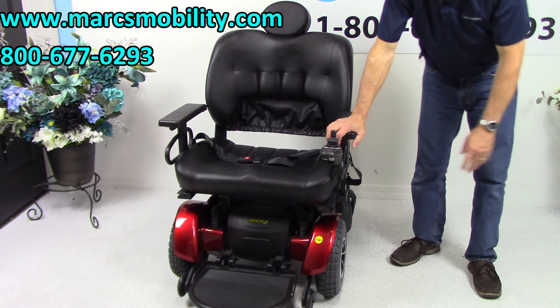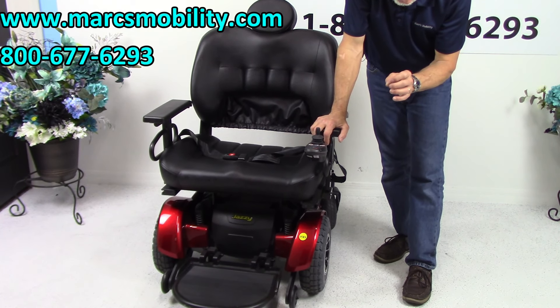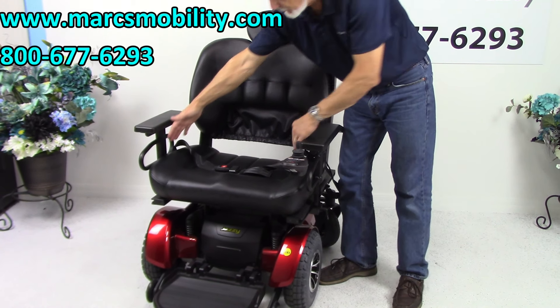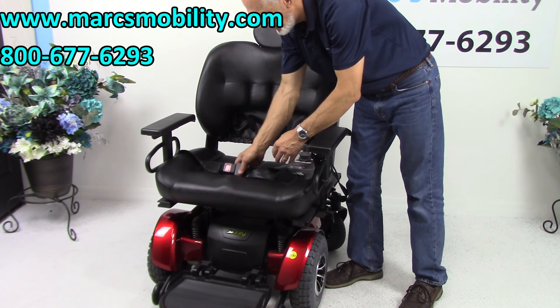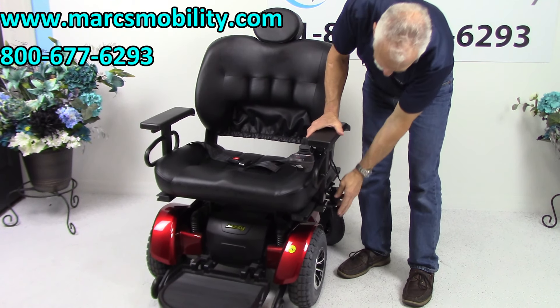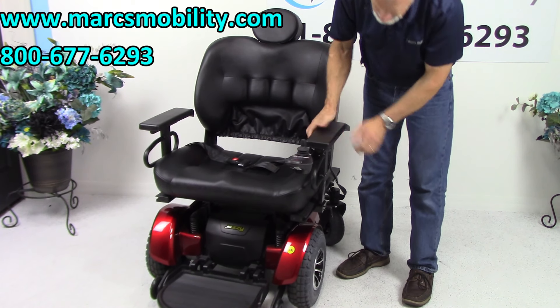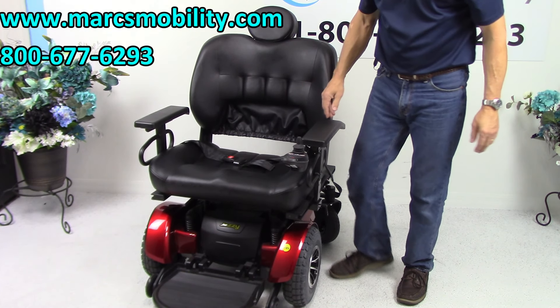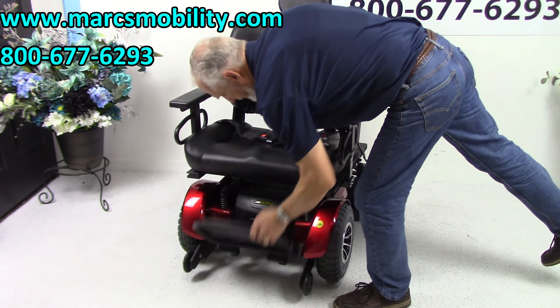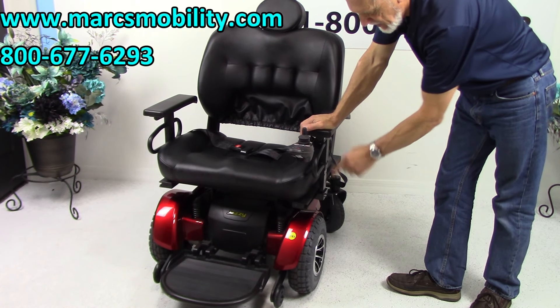To recap: this is a heavy-duty power chair with a 600 to 650-pound weight capability. It's the Jazzy 1450 with a 26 by 20 seat, a safety belt, and solid arms that can be removed if you need to enter from the side. Joystick is on the left but can be moved to the right. Flip-up footplate. Heavy-duty solid tires and heavy-duty motors. A powerful chair with an extra-large seat.